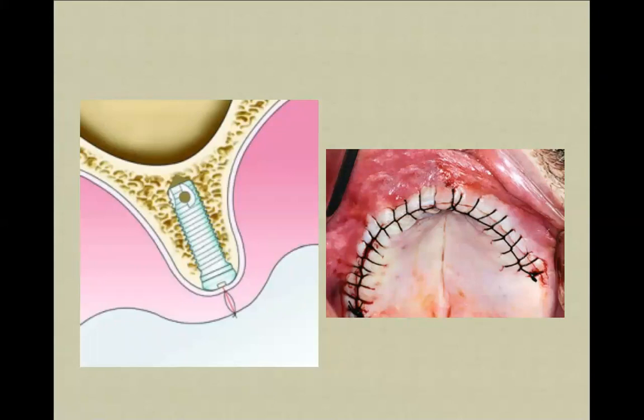So I like it on the maxilla, but I don't like it on the mandible, because on the mandible there's a very small chance that your implant is too deep and interferes with the inferior alveolar nerve. So if the day after, on your checkup, you find that there's numbness here, you have to unscrew your implant at least one or two steps, or one or two threads.